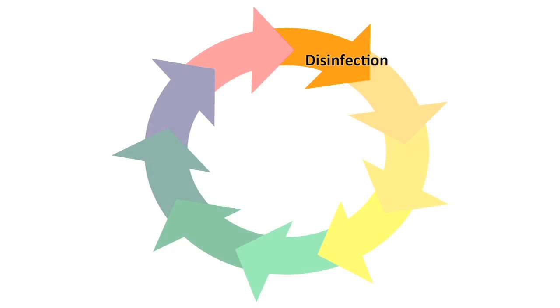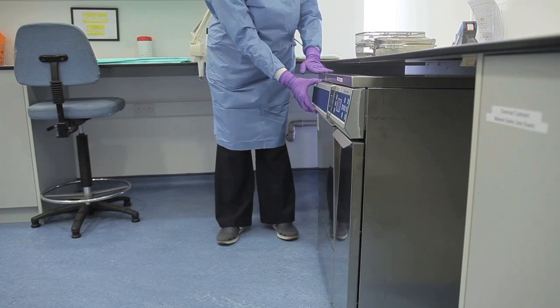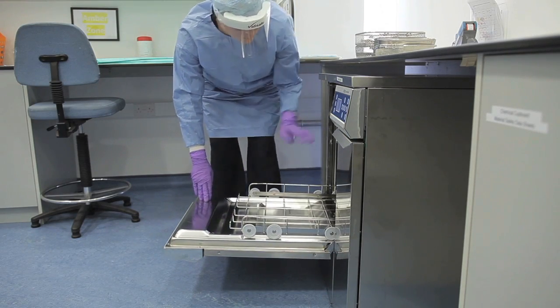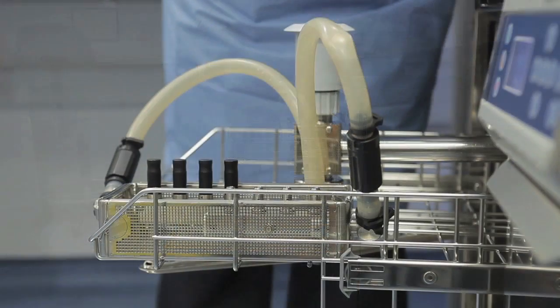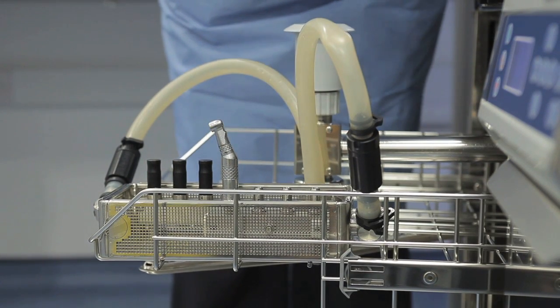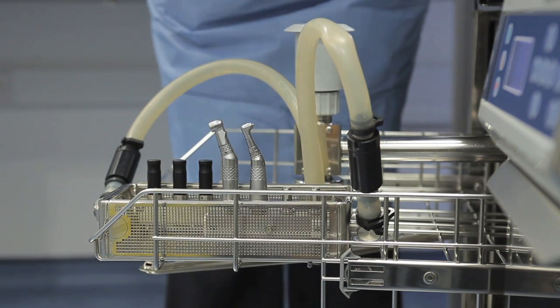Step 3 of the life cycle is Disinfection. Here the dental healthcare worker prepares and loads the RIMD into the washer disinfector for thermal disinfection. It is important to note that thermal disinfection only occurs when a washer disinfector has been used. The dental healthcare worker opens the washer disinfector and places dental handpieces onto specific adapters provided in the washer disinfector. These are designed to facilitate cleaning and thermal disinfection of the complex internal components and channels of handpieces.